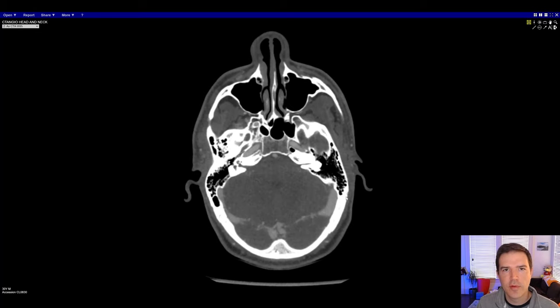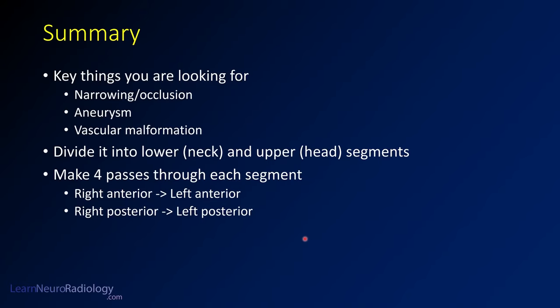That's basically all you need to look at for your CTA of the head and neck. In summary, we've taken a look at the general approach to a CT angiogram of the head and neck. It's good to have an idea of what you're looking for — narrowing or occlusion, aneurysm, or vascular malformation. Divide it into segments: lower neck and upper head. Take four separate passes, going from anterior to posterior and then right to left, so that you're seeing all of the vascular structures.